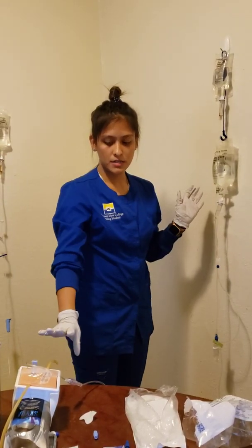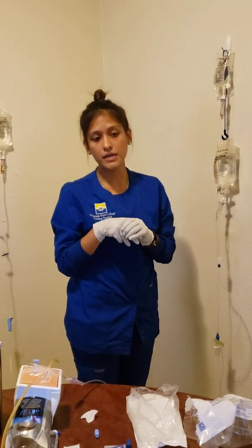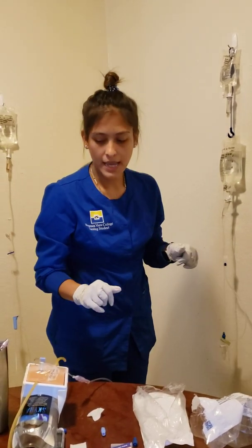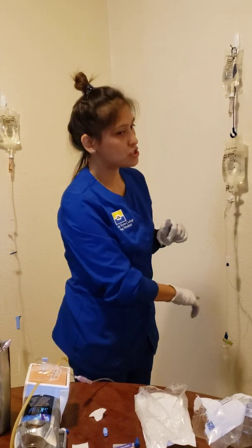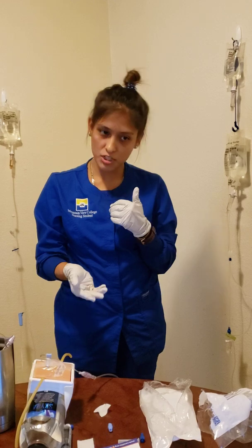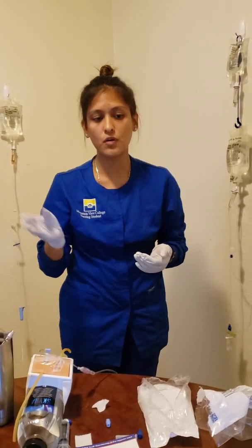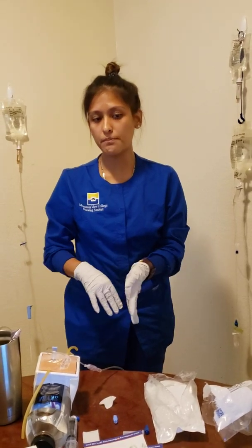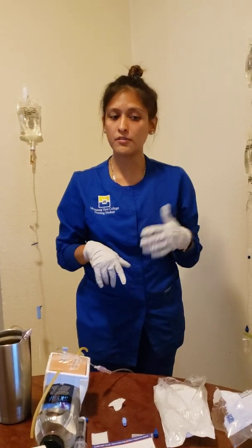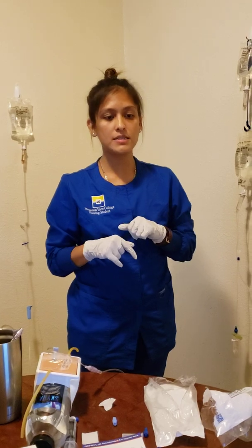So everything is good. I've already explained to Miss Chi that she may feel some nausea or diarrhea. So I am going to go ahead and unclamp everything. And I'm going to go ahead and push start on her pump here because I've already done my third check. And so again, I'm gonna just address this to Miss Chi. Miss Chi, you may feel a little nauseous, okay? So here's your call light. I'm gonna lower your bed and put your rail up. Please call me if you need to get out of bed or if you need to use the bathroom. And I'll be back within 30 minutes, okay, to see how you're feeling.